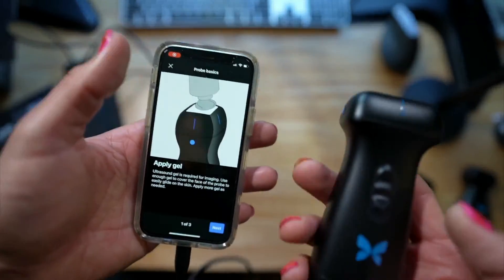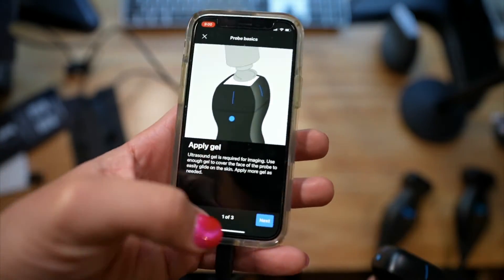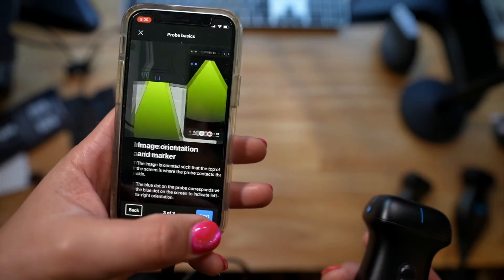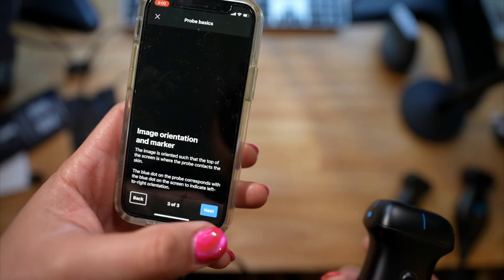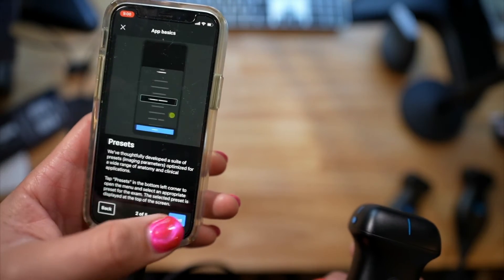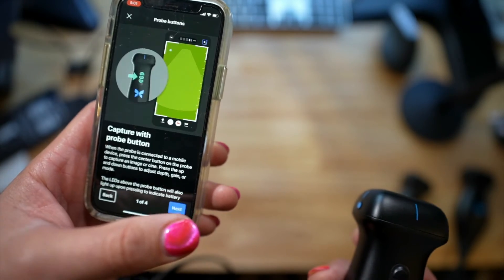When you first plug it in, it wants you to register the device — which I already did — and then it walks you through a tutorial on how to scan, which I like. You can definitely go through that if you want. It walks you through some app stuff, which we're very familiar with because we actually use the transducer quite a bit on shift.